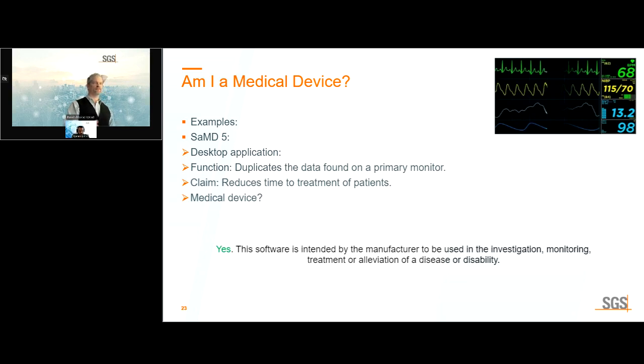The answer is yes. Once you start making that very explicit claim, that you are going to clinically reduce the time to treatment for a patient, you're absolutely now inside of the medical device space. So this is sort of like the treadmill example. Over in the corner, duplicating data, making no claim, not intended to be used in that way, not a medical device. Same exact software with a medical claim, now you're a medical device. Okay, so now we're starting to get a handle on what is a medical device, right? We're starting to understand that.